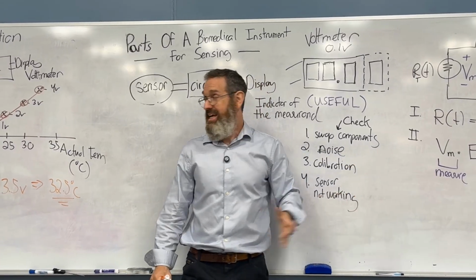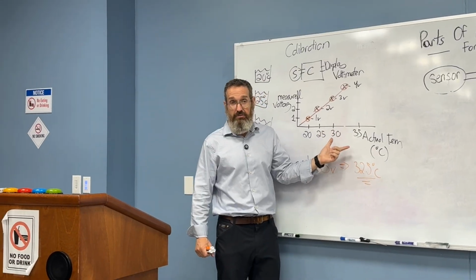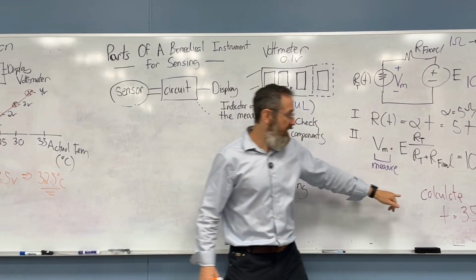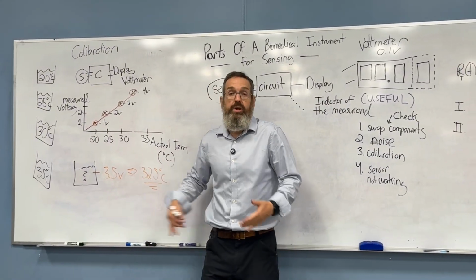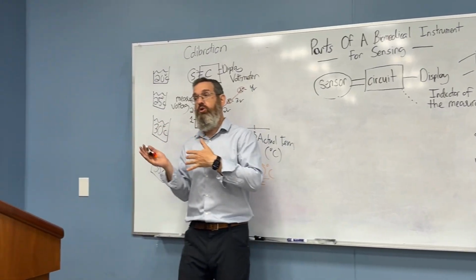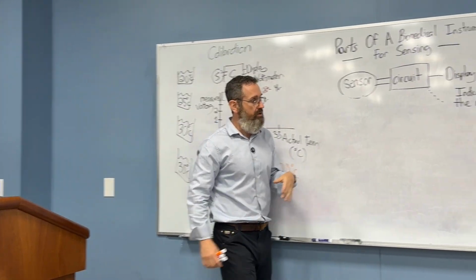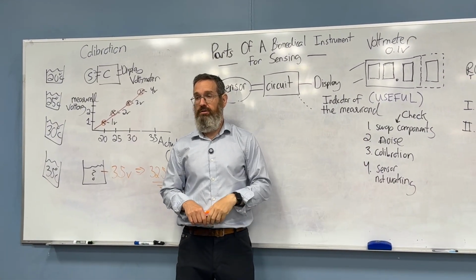In that case, you are not using the calibration as an end in itself. You were actually using the calibration in the sense that if the calculation does not match, we need to do something. So those are 2 uses of calibration, and there'll be additional ones as well. So that's your introduction to calibration as one tool we use in making our instruments work better.